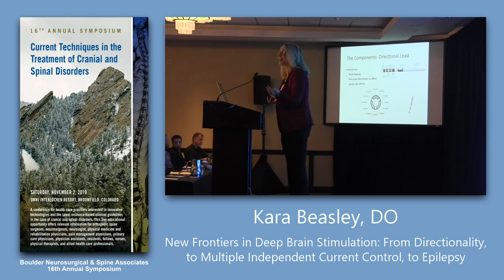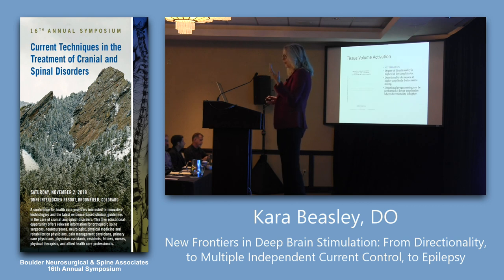The other thing it's allowed us to do, and I'm going to tell you honestly, is that there are folks out there who don't have fellowships and who say, oh, it's just stereotaxis, I can just put something in the brain, I can put a lead anywhere, it's not that hard. In those poorly placed leads, it gives you an opportunity to salvage the lead rather than the patient undergoing brain surgery. But very interestingly, we now talk about something called tissue volume of activation.